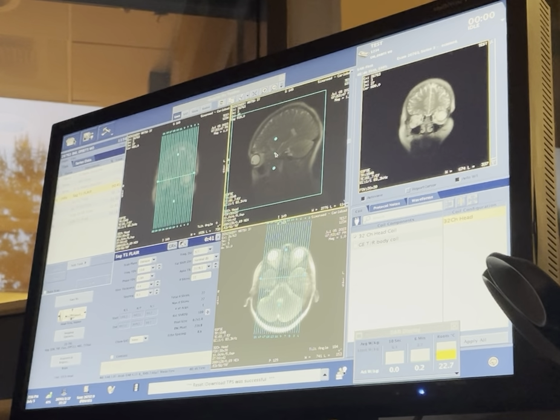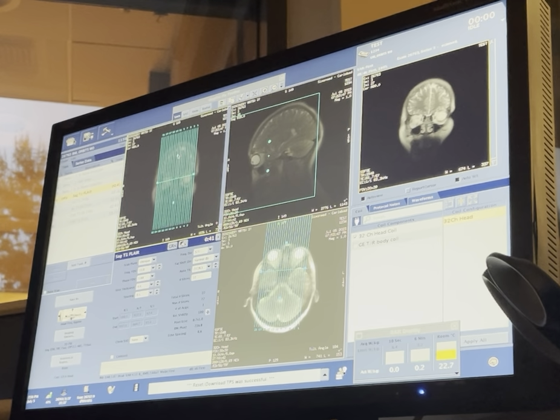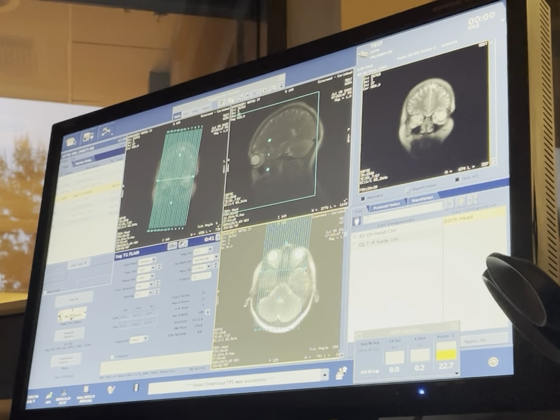Now I'm gonna have you angle with your coronal plane. Angle with the orbits. Yeah, that looks good. And now, it looks fine in your sagittal plane, I'd say. You can maybe add a slice on the right and you're good, just to be safe. There you go, okay.